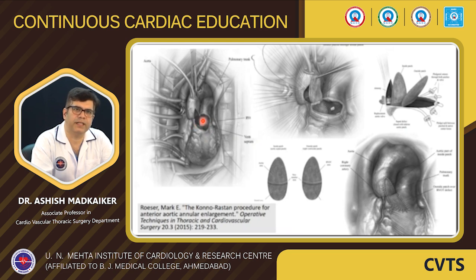There will be a ventricular septal defect in subaortic or subpulmonary position, and this is the RVOT opening, and this is the aortotomy opening. Now we need to close this defect with a two-layered patch, an oval-shaped two-layered patch. So if you see the patch, this particular portion of the patch will be used to close the ventricular septal defect. This will form the new annulus at this junction.